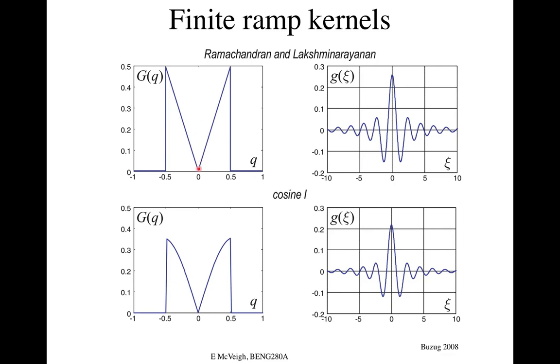And then as we go to higher and higher spatial frequencies, with these higher and higher sinusoids, they just get ramped up linearly and then shut down entirely at a cutoff frequency, right? This is a terrible filter. It's a really nasty filter in terms of creating image artifacts. But it is the theoretical filter that is required to get the truth, the continuous object, so you have to deal with it.